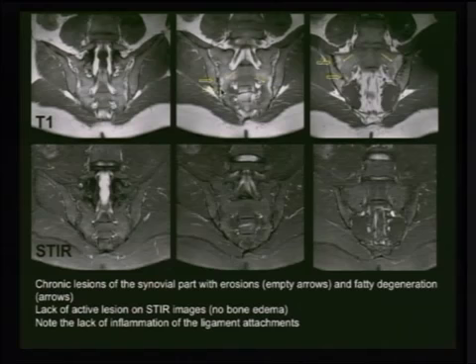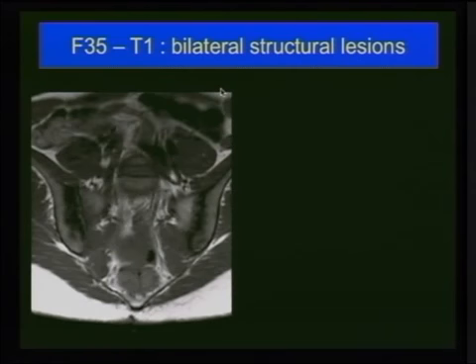So we are confident here that everything here is of a chronic nature. There is no evidence of edema at all. So this is a chronic case of the sacroiliitis.